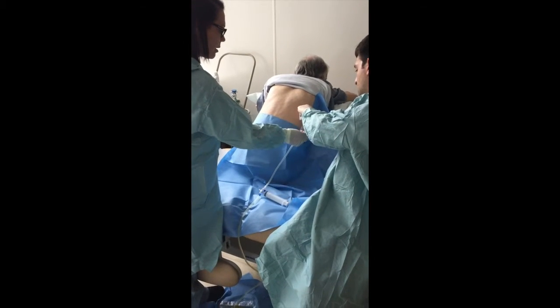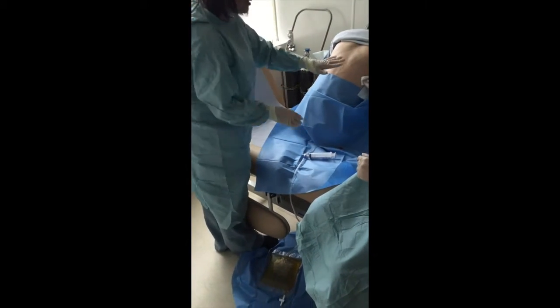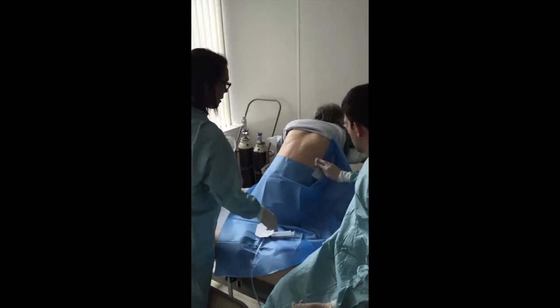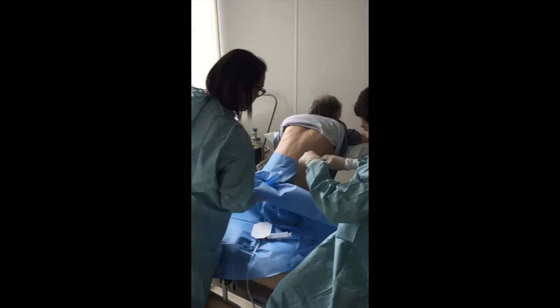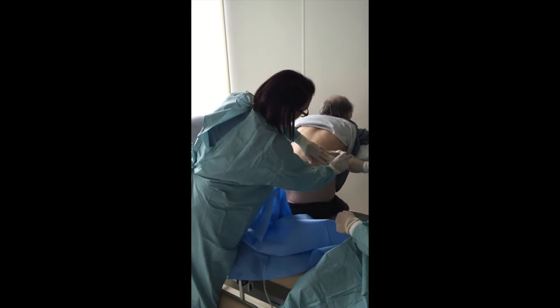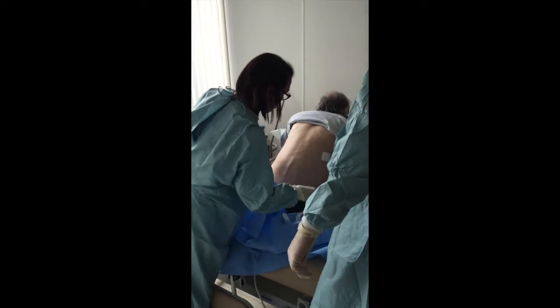Okay, and that's out. And then what we'll do is we'll just turn that three-way tap on so we don't get any backflow. I can leave that there, I can deal with it in a minute. And what I'm going to do is just put a dressing on that for this patient that can stay on for about 24 hours. I'm just going to take some of these drapes off for you, sir. You're all done now. Is that okay? Yeah, fine. Great. Leave this on. Yeah. So just take your fingers away. There's the dressing on. And that's all done.